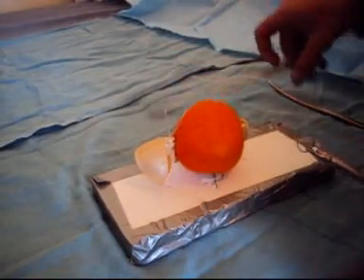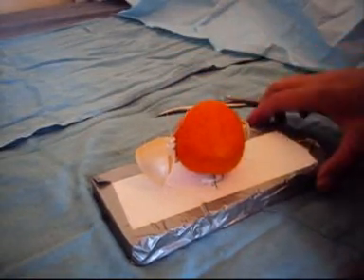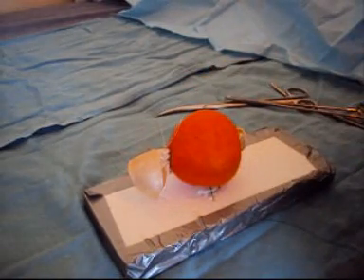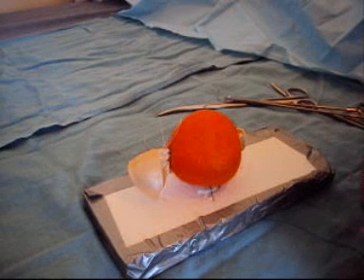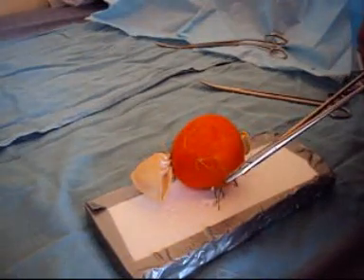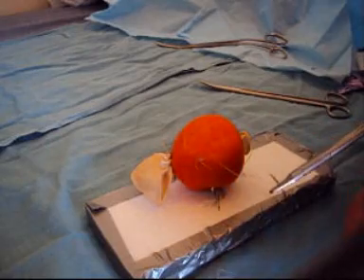We just cut that away. So now we can see that we have a model which has been fixed down and is ready to be practiced on from the point of view of an open retropubic simple prostatectomy.